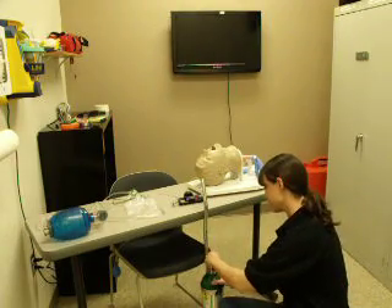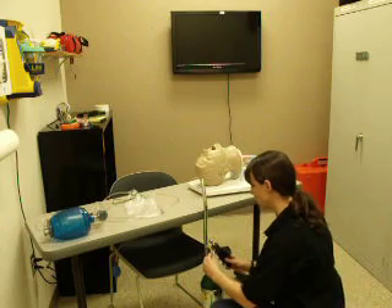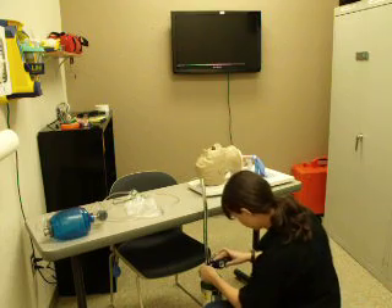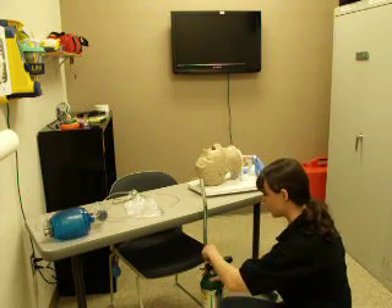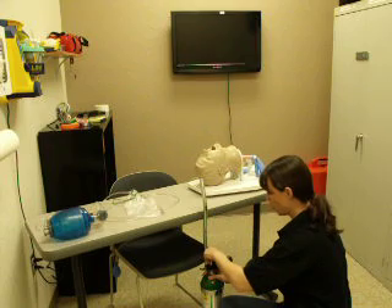I'm going to crack the tank, making sure to blow off any dust that's in there. Selecting my regulator, and I'm going to assemble the regulator to the tank, making sure the regulator's at zero so it doesn't hiss as soon as I turn the tank on. Turning the tank on, all the way open, quarter turn back.